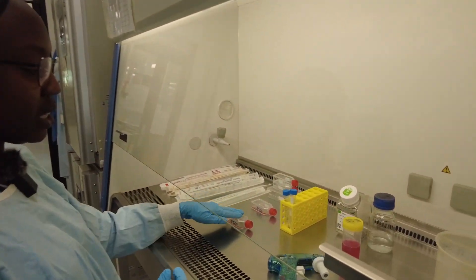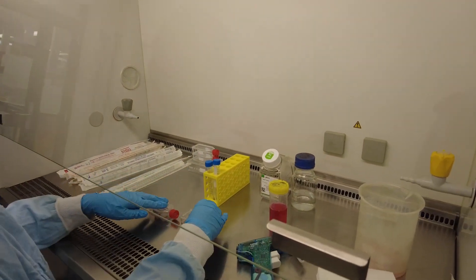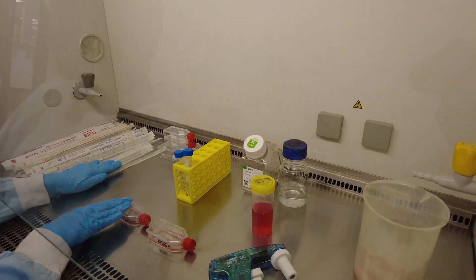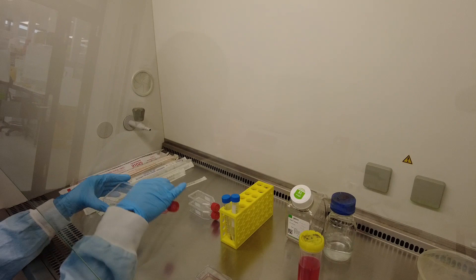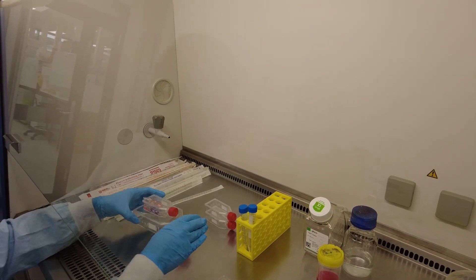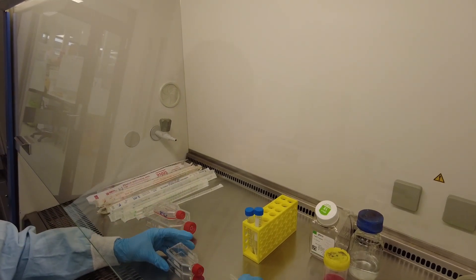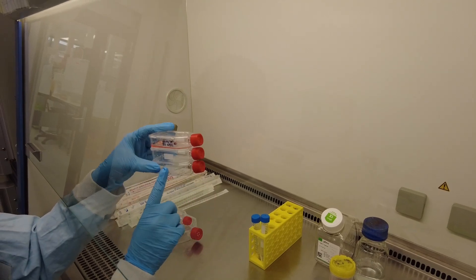So now we're going to split these two flasks. There's more cells in this second flask. So we're going to put it into the bigger flask there so it can continue growing. And then we're going to split this into two smaller flasks.